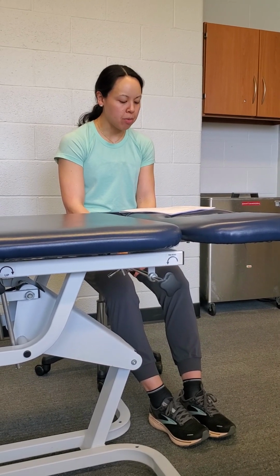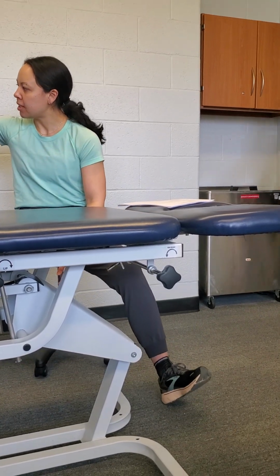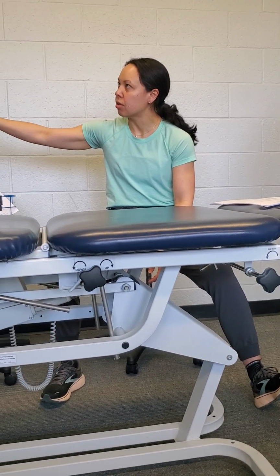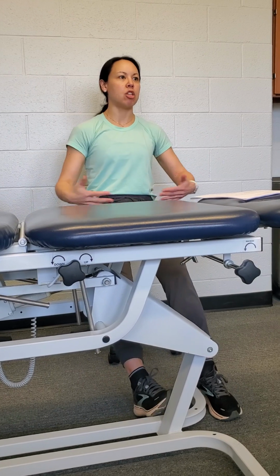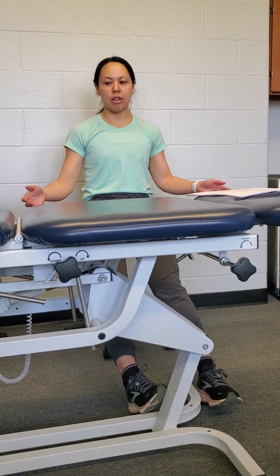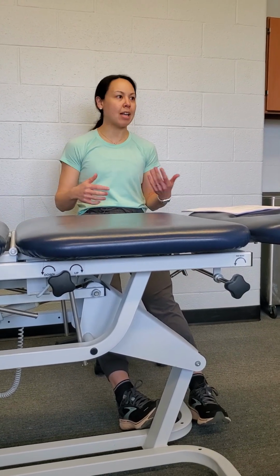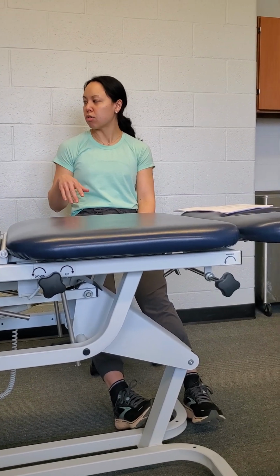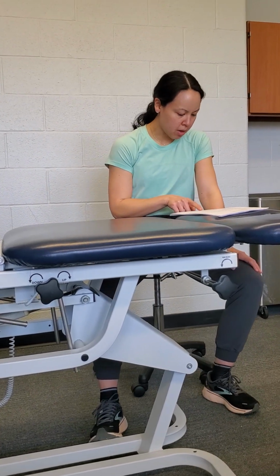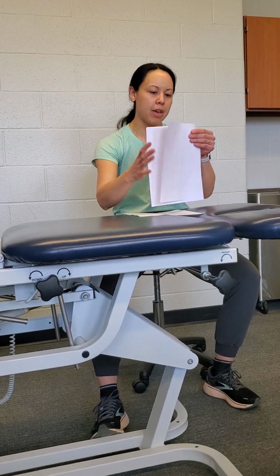And you're going to perform the Doppler every session. And the Doppler is called PTP, so I believe that stands for personal tourniquet pressure. That's when I was saying, you're going to have the patient lie down. They're not going to talk, they're just going to completely relax and not move. And you hit the PTP button, that's doing your Doppler. And then that's when you're calculating their personal tourniquet pressure, or their limb occlusion pressure. And you would record that in your documentation. That's really important to document that number.